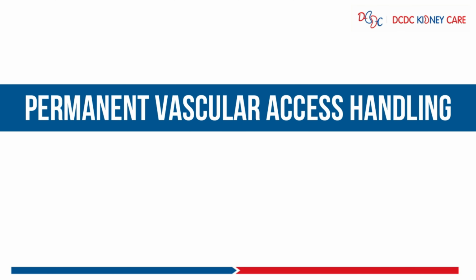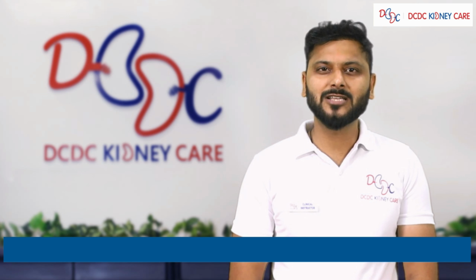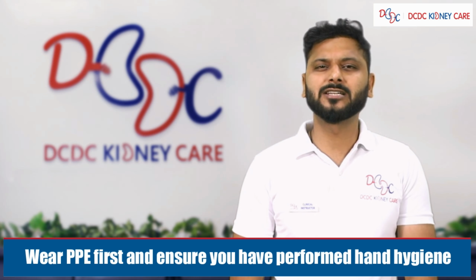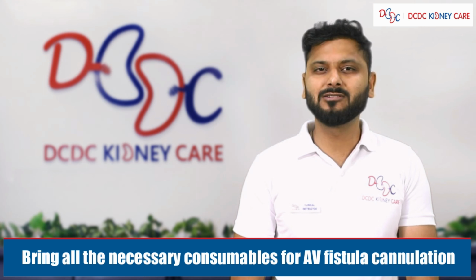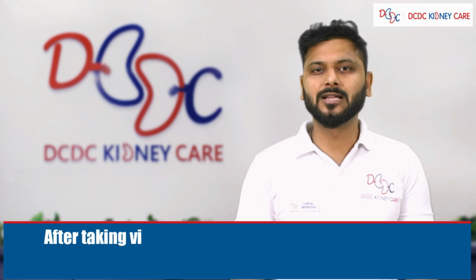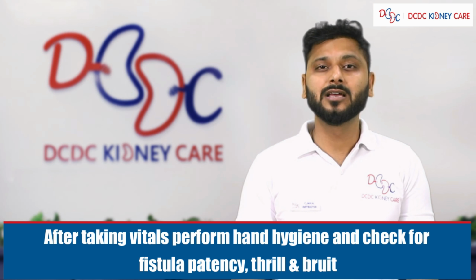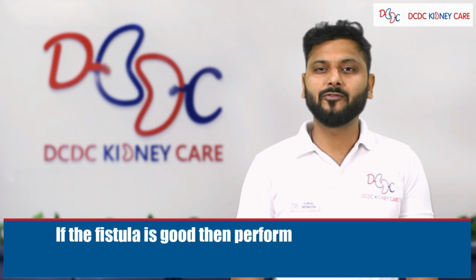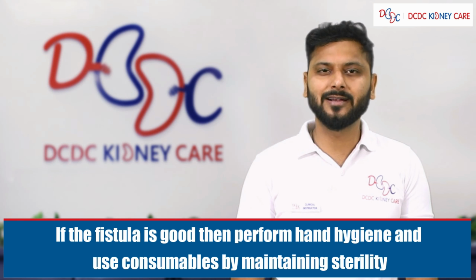Permanent vascular access handling. AV fistula handling during HD initiation. Firstly, wear PPE and ensure you have performed hand hygiene. Bring all the necessary consumables for AV fistula cannulation. After taking vitals, perform hand hygiene and check for fistula patency like thrill and bruit. If the fistula is good, then perform hand hygiene and use consumables by maintaining their sterility.